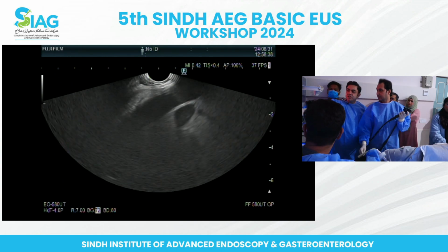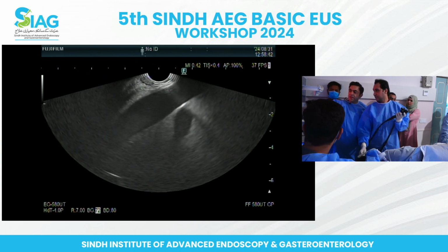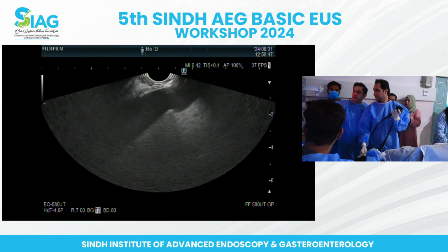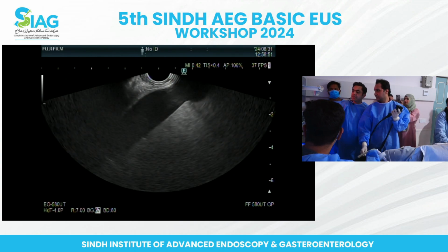So that's the image that you want of the aorta. Keep on turning around so that you can get a 3D image of where you are. And I'll see if I can optimize this image a bit. Yeah, I'll do it manually.